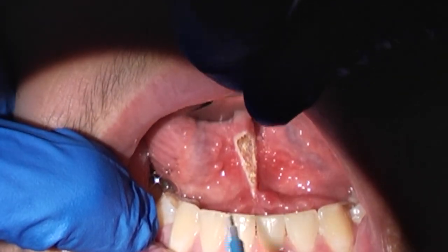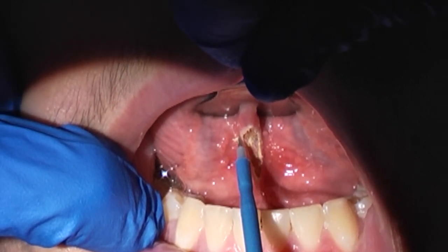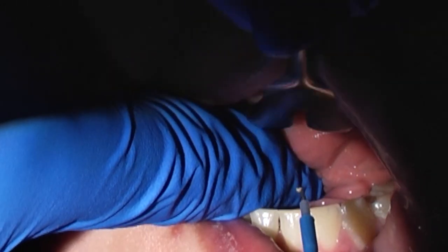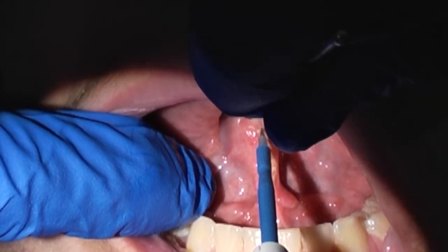Once it is under tension, the monopolar cautery is used to transect the lingual frenulum. Care is taken to stay away from the submandibular duct papillae, which were identified before. A gentle push with the finger completes the division of the frenulum, and if any little bit is left posteriorly, this is further divided.